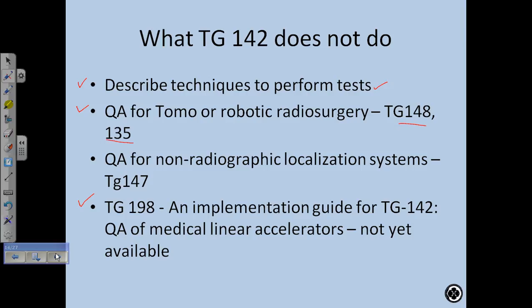How often do you do QA on the tomo? We have monthly and quarterly. Quarterly? Okay. How long do they take? I haven't actually been around for any of them yet. Okay. How about robotic? What do you think robotic radiosurgery is? The CyberKnife. CyberKnife, yeah. Some people think robotic is the 6D couch, but it's CyberKnife.